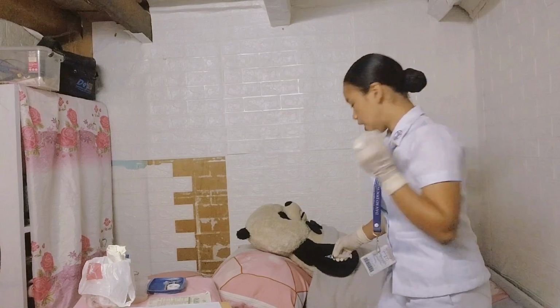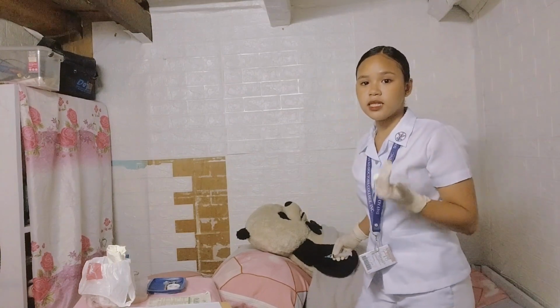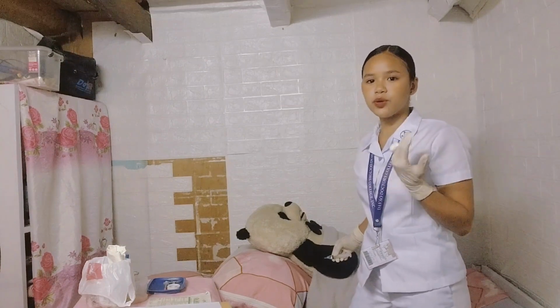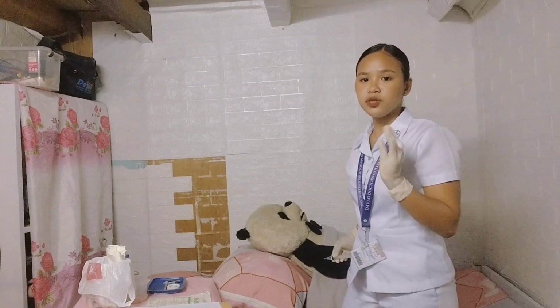If the needle is in a small blood vessel, it takes time for blood to appear. If blood appears in the syringe, withdraw the needle, then discard the syringe and prepare a new injection.